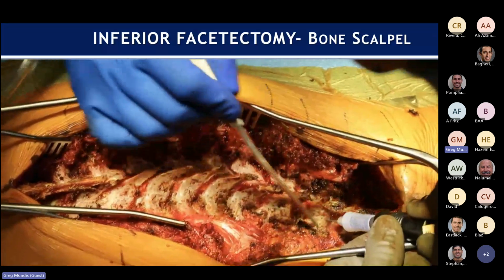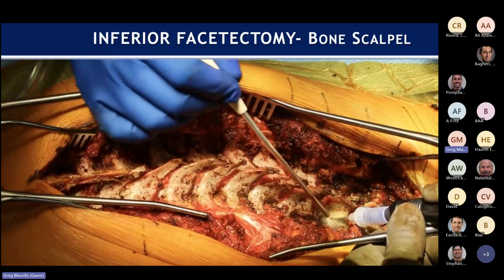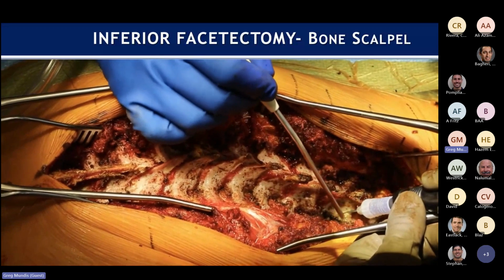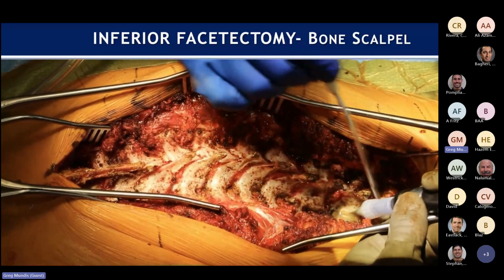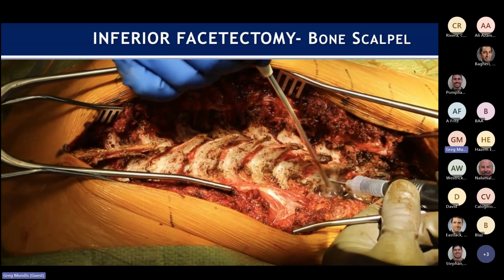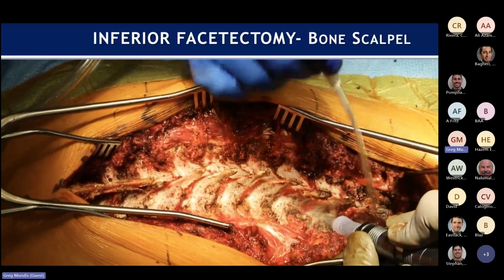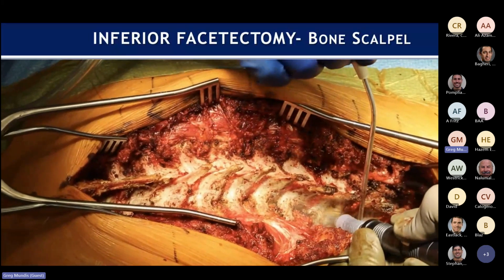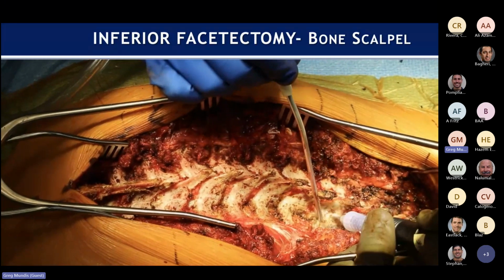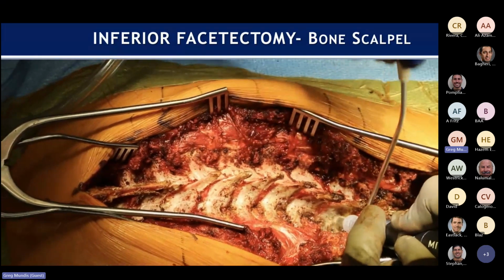Good. So, the bottom line here is that you're just trying to get the superior articulating process, the cartilage, exposed there. And so you just take down the IAP at all these levels. Now, some would call these osteotomies. I don't necessarily, I think it's part of releasing the spine. So I do think there's a long continuum of releasing the spine, and this is certainly one part of it. But when you talk about things like billing, I wouldn't necessarily say everywhere where you do an IAP resection is necessarily an osteotomy. To me, it has to do more with where you're intending to release the spine to do the correction. But this is definitely a way to get things to be looser up and down.